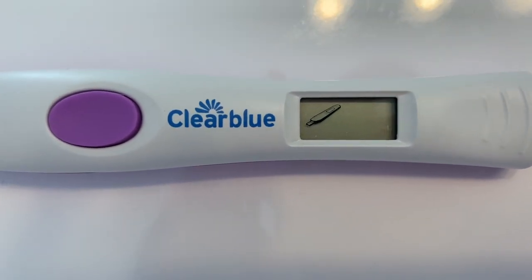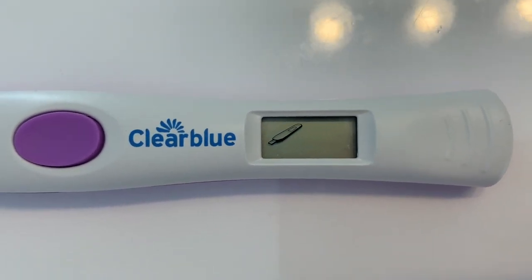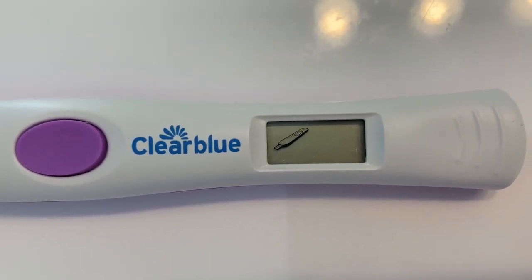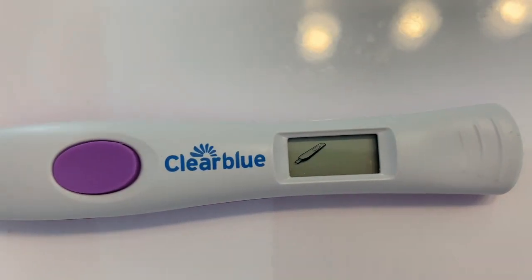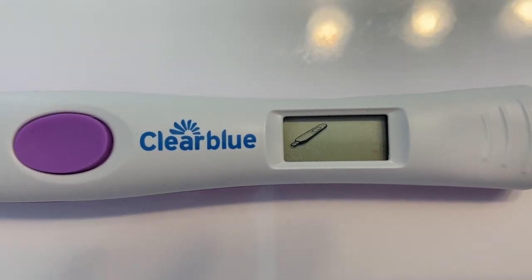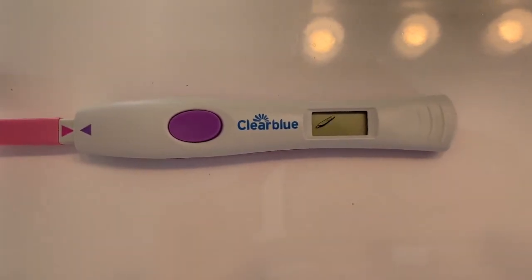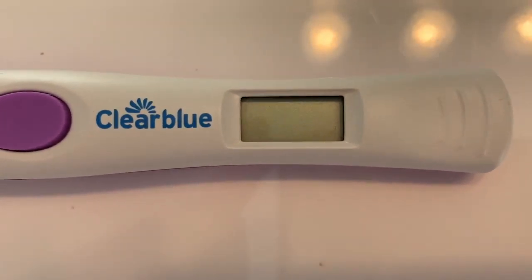Before that cut out, you could see that when all 3 of those little icons flash, that means the test has pretty much started over. And so here we are. I am using a pink from the new pack I bought. It does not matter. I have used them interchangeably for like a year, and it's all the same. Even on clearblue.com, they say if you have test strips left over, use them again the following month. What's different is, of course, the technology in the wand itself. Okay, it's been about 4.5 minutes, so it should be coming up pretty soon.